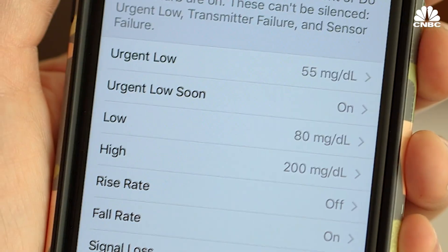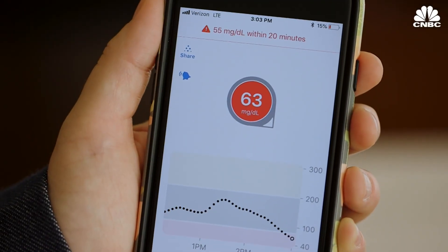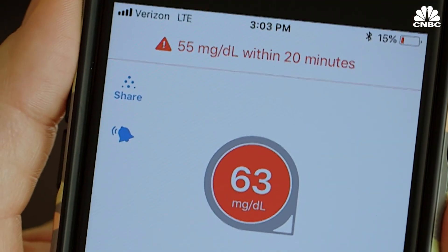There's a new feature that I really like called Urgent Low Soon. It warns you when you're 10 to 20 minutes away from reaching a dangerously low number.